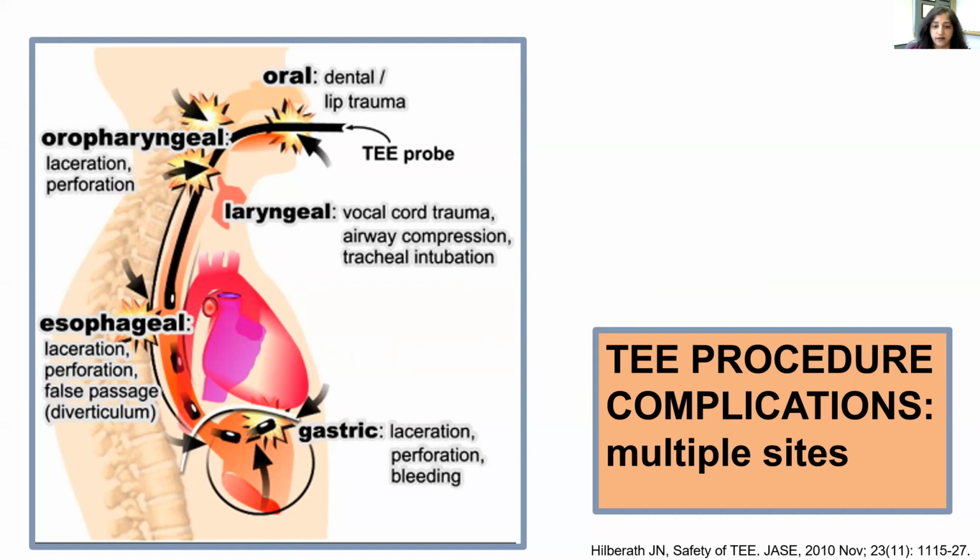All of these should be evaluated for before the patient leaves. Typically, blood on the probe signifies that there has been some trauma, and the extent of it should be evaluated prior to the patient leaving.